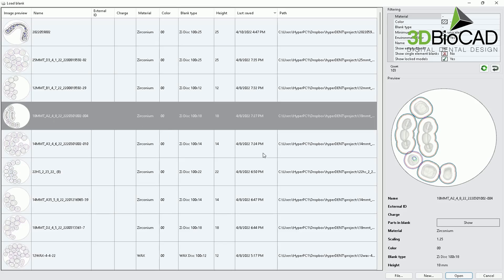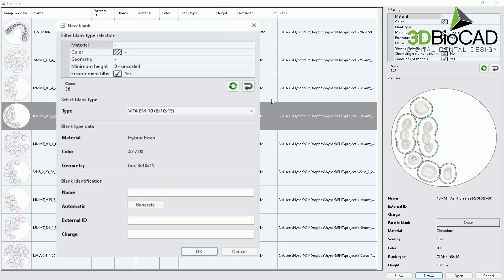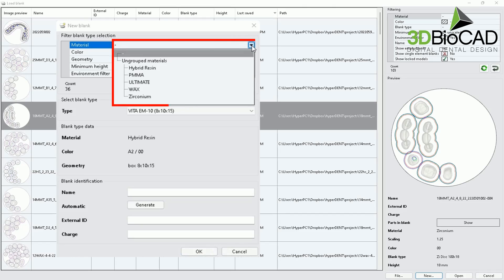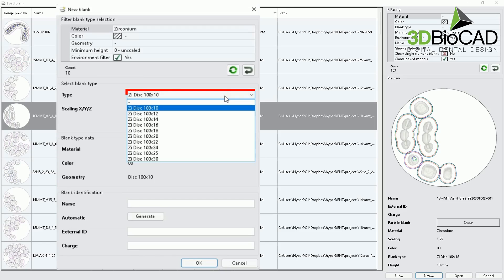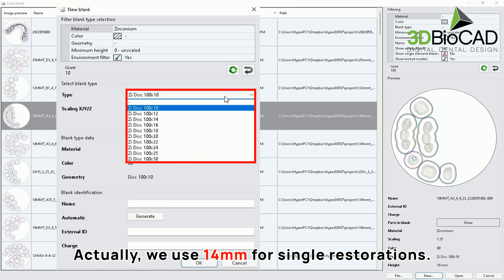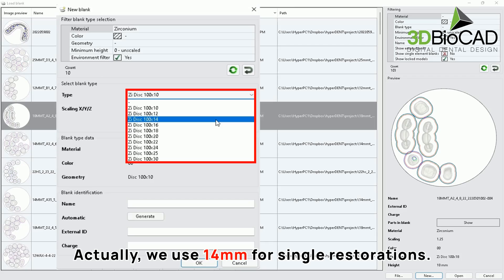This time, I'll go ahead and select new. And under material, we can select different type of materials. For this time, we'll select zirconium. After selecting zirconium, you'll be able to select different heights. Usually, with the single restorations, it fits mostly on zirconia disk height 16. So I'm going to select 16.